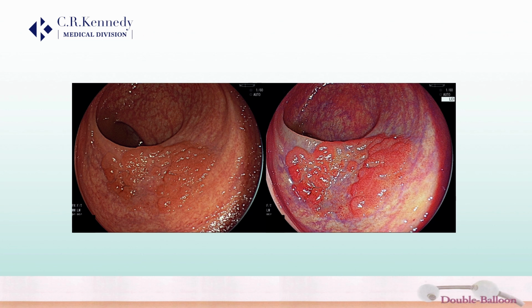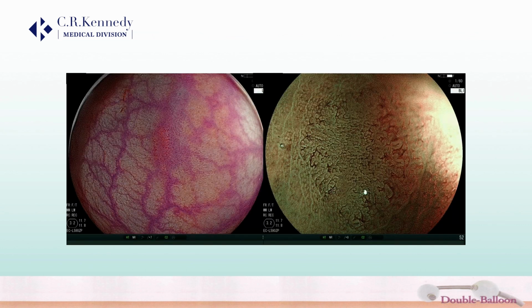And the same in the colon. This is the white light image. The color tone is the same, but using LCI, surrounding mucosa becomes purple because of the deep vasculature, and the neoplastic mucosa becomes orange because of the shallow vasculature. And after detecting the neoplastic area, change to BLI and magnify and make sure this is a neoplastic lesion.